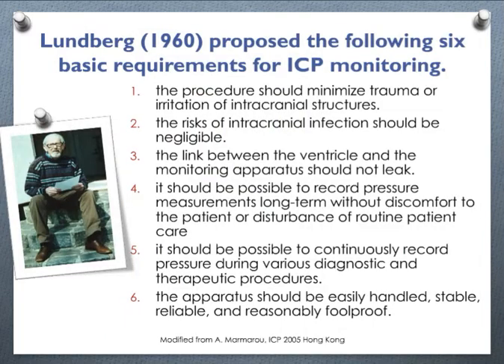This man is Lundberg, one of the pioneers of the recording, and he said in the 60s some criteria that Anthony Marmaro reported at the ICP in Hong Kong in 2005. And I think all the criteria needs also to be present today. The procedure should minimize trauma to the intracranial structure, so we need to use a small catheter. We have to contain the risk because there is a risk of infection. And at this stage, the leakage of the system was a problem. It's not an important problem today. But we need to record for long term, without discomfort of the patient, ICP.